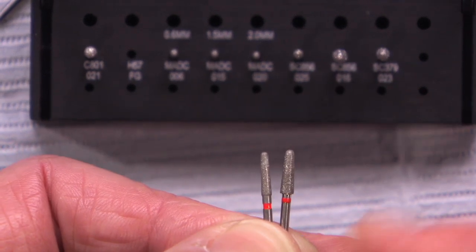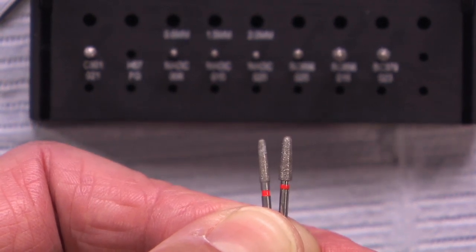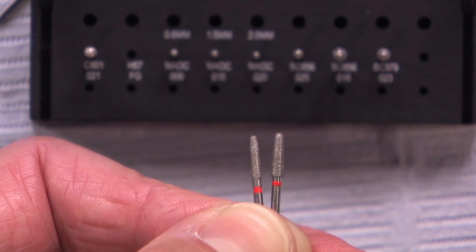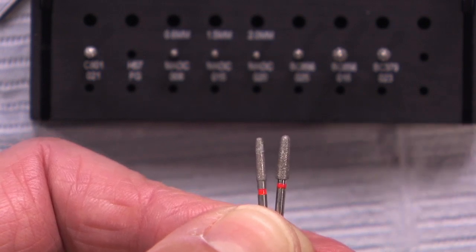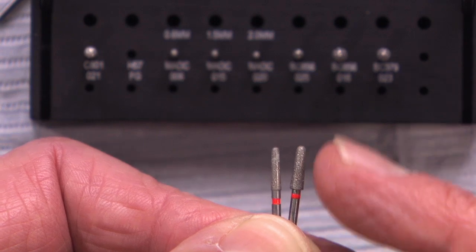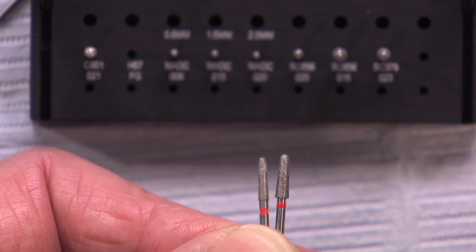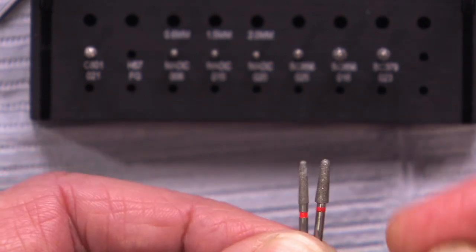When I used to only use the super coarse burrs to finish my margin, and I would take a digital impression and it would show me the prep on the screen, I could see all the little chips out of the margin. And I realized that when using magnification, my technician was going to have a question about what to include in the restoration and what to ignore. So now I go over it with these fine grit burrs at the very end and smooth off that margin. And now I don't have any huge chips out of the margin, even when I take a digital impression, which blows up the prep 30 times on the computer screen.